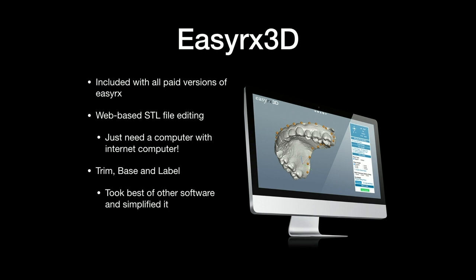It took the best of other software, so if y'all have heard of NetFab, Mesh Mixer, all those, it took all those that aren't dental based and just collected all the pieces we need as a dental lab and condensed it all together. And now they just added artifact removal and now bracket removal. So now you can remove brackets off the teeth before you print. A lot of doctors will take a scan of the patient before they get their braces off, and we take the brackets off, just like with plaster models.